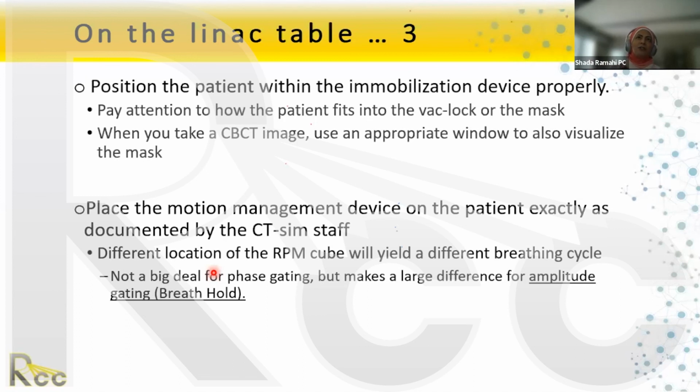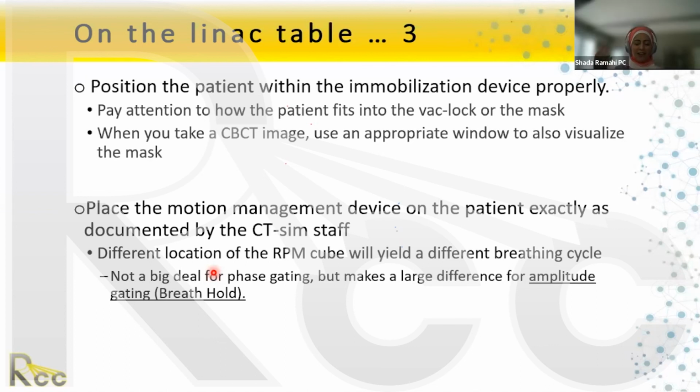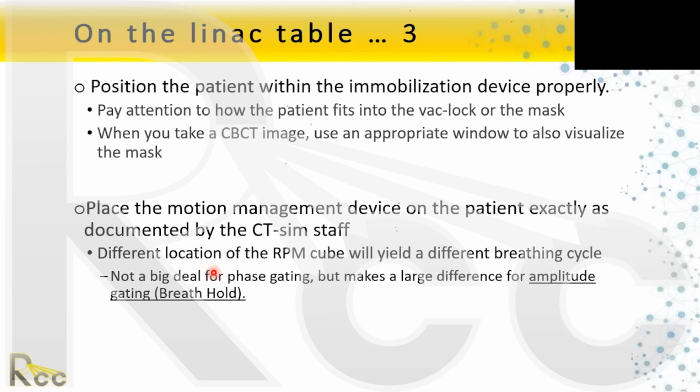Now, what are we concerned about when we're thinking about getting the skin match? SGRT. Surface guided is extra work for the therapists that helps them. And you can use the SGRT even for other patients who are not stereotactic. You can use it for breast patients for sure. Correct. Whatever you can do to help the alignment on the patient is needed, honestly.